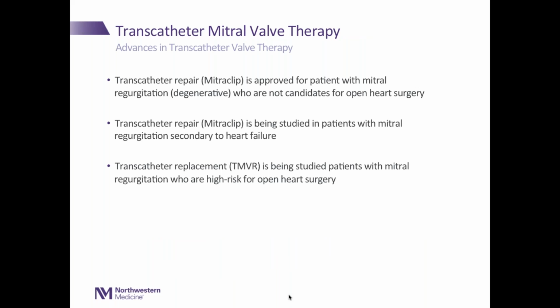So the summary: transcatheter mitral valve therapy is a therapy meant for patients with mitral regurgitation or leaky mitral valves. Most patients will do very well with open heart surgery. Occasionally, minimally invasive mitral valve surgery will be an option for some of these patients. For patients who are too high risk, we have transcatheter therapies available. The one that is currently commercially available and FDA approved is the MitraClip procedure for leaky mitral valves. We are currently investigating trials using a complete transcatheter mitral valve replacement, which is a very exciting therapy we hope to see in the next several years.